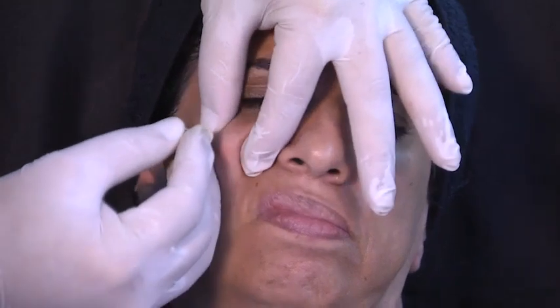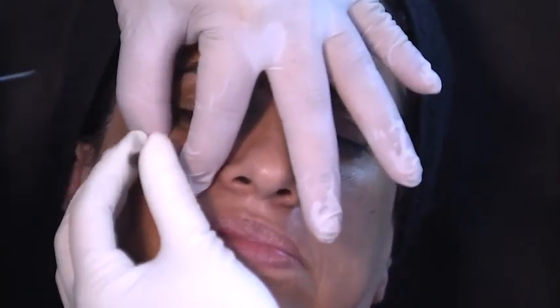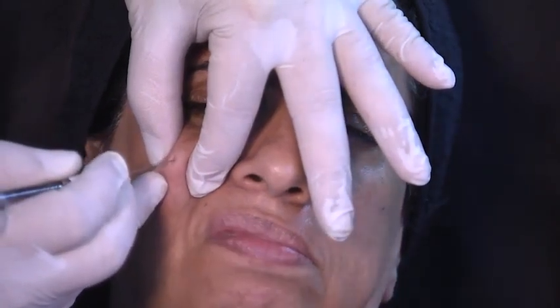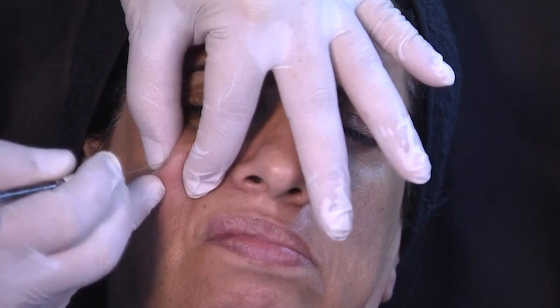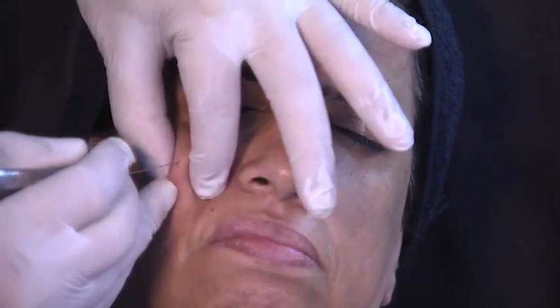You can see that this side that we have treated was in much worse condition. So this is the reason why we started here, because if we start here, where she doesn't look that bad, you will never get the same result in this area. So she will always look sunken. Okay? So final point here for the mid face. Entry point.